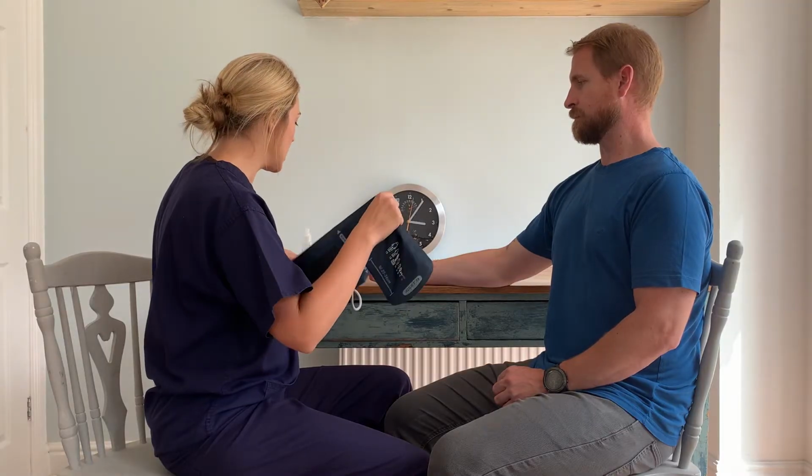No, it's fine. Okay. It's always worth checking that just to make sure that there's no arm pain, trauma, or if your patients have had previous surgery, which means they've got lymphedema, it means that you can't use one of their arms to take a blood pressure. So if I could just ask you to pop your arm up on the table for me. Sure. So you get your patient to rest their arm on a table or pillow just so they're relaxed, and they're not tensing their arm at all, so again it won't give you an inaccurate reading.